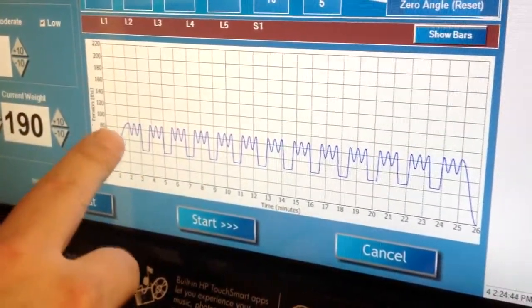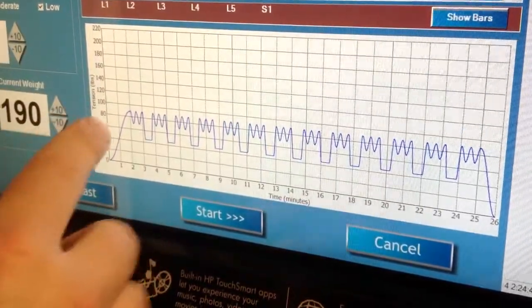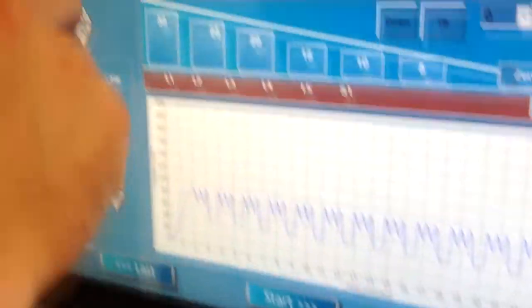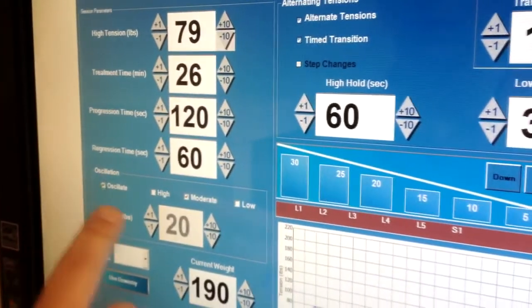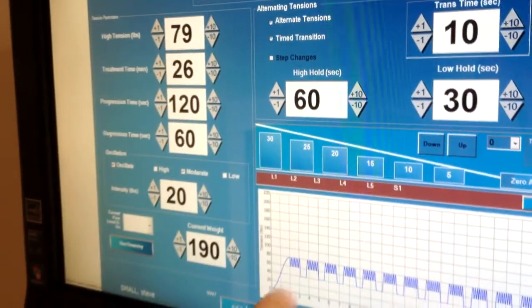Another possibility that we can do is if we want to, this is quite a high tension, we might decrease the tension. So we've brought that down to 79 pounds.